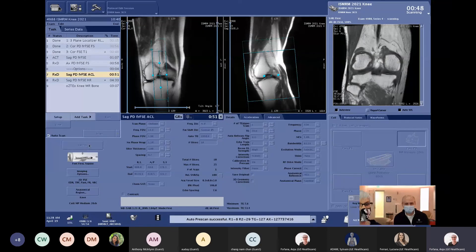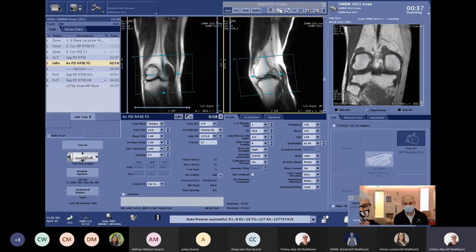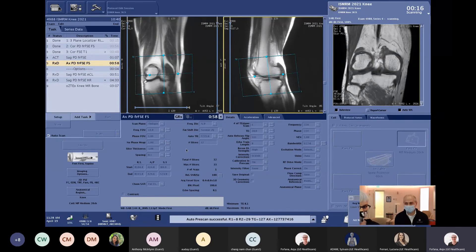One thing to note about the short scan times: if you open series five — the axials — AIRX is automatically prescribing the slices. Look at the coverage going through the sagittal images: you're above the patella and it also goes down below the head of the fibula. The number of slices is 32, and we're only getting that in 58 seconds — that's great scan time. With Air Recon DL for speed, you can really consider scan times around one minute, and if you need four or five series, your routine knee protocol would only take five minutes.